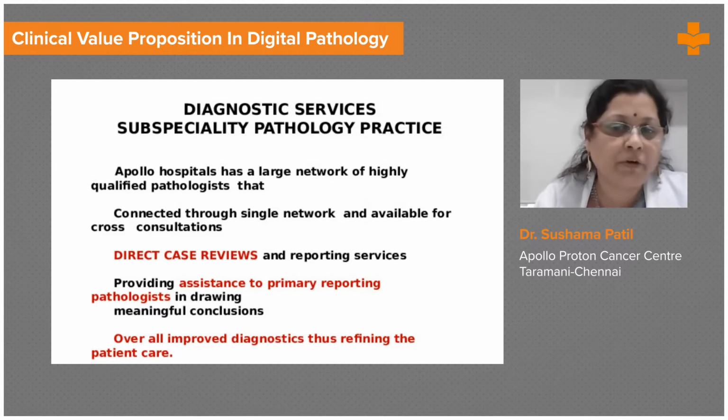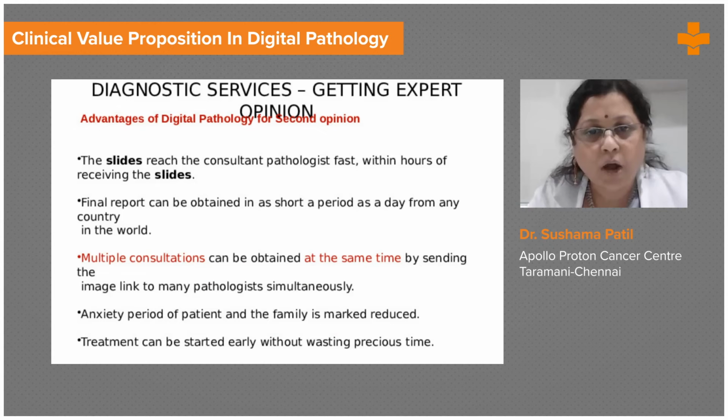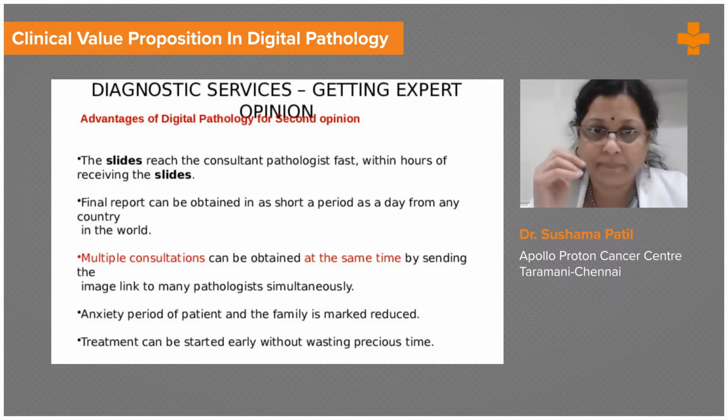And we can put both of our names and say we have reviewed the case and give the patient the benefit of improved diagnostics. What this does is that overall there is improvement in diagnostics, and thus it will help refine patient care. So what are the benefits that diagnostic services provide through digital pathology in getting an expert opinion?